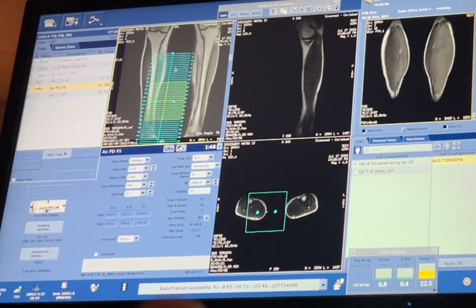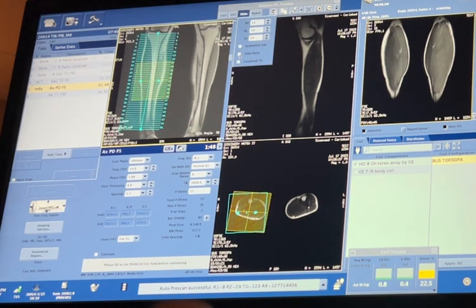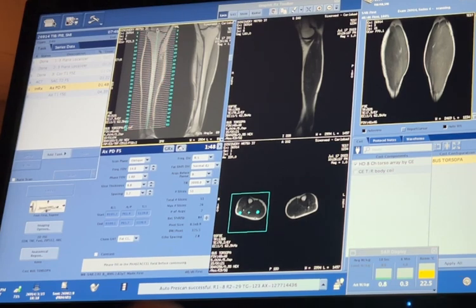Okay, so I want you to put the shim box right on it, and then I want you to erase it. Or hide the shim. So now I'm going to have you angle it. Maybe a little less. Just a tiny bit less. Perfect. Now we're going to add 1 or 2 slices above the tibial plateau. There you go. And let's go down as far as we can.